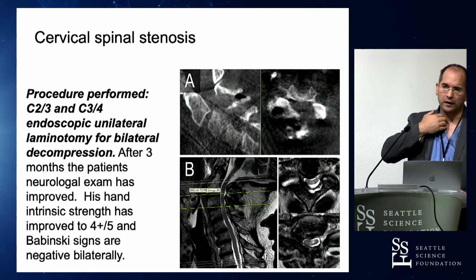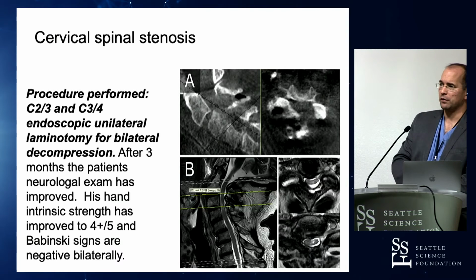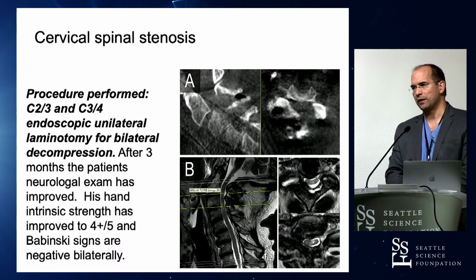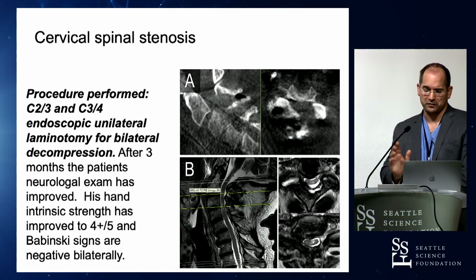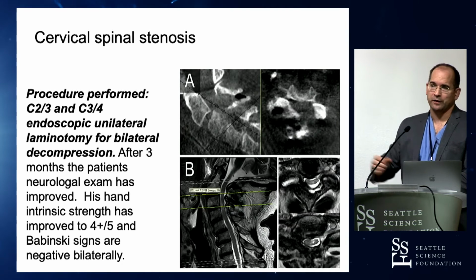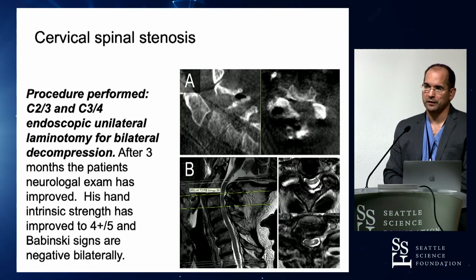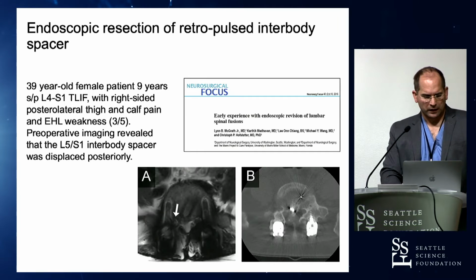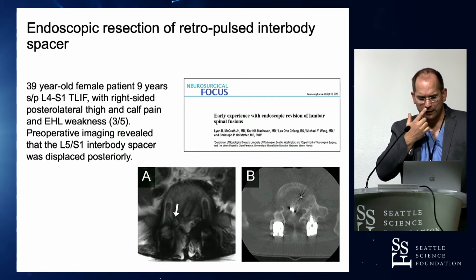And again, I don't want to prolong this too long, but I would challenge anybody: for these last two cases, there's really nothing in the world right now that would have been better for these two patients. Anybody. We can discuss it afterwards, but not to my knowledge. Obviously, you can do this case via tube too. It's not a big deal. But the precision you get with the endoscope just allows you to do these surgeries much safer and much more precise.